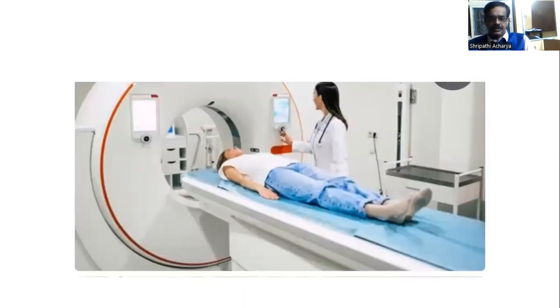You can see the patient is made to lie on the bed, and the bed itself along with the patient is made to enter the aperture, the circular area, which is surrounded by detectors, and some radioactive substances, radioisotopes, are injected, and they go to the bloodstream, then they enter the brain, and they will bind with the body proteins, such as enzymes or neurotransmitters, and the distribution of the radioisotopes is then detected by the detectors.